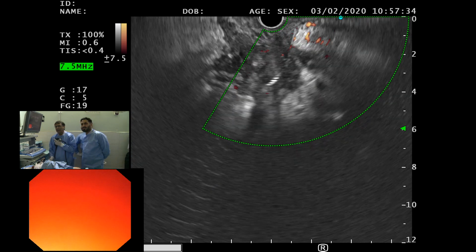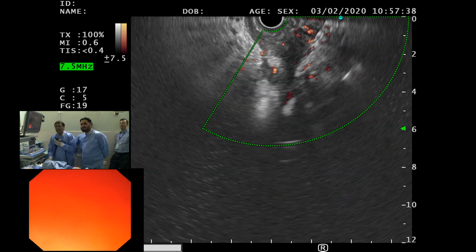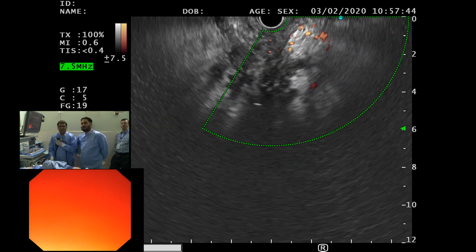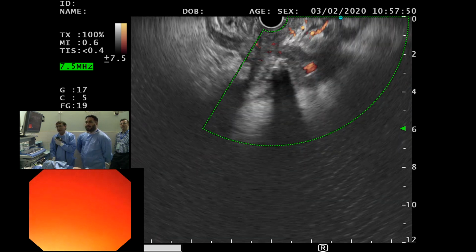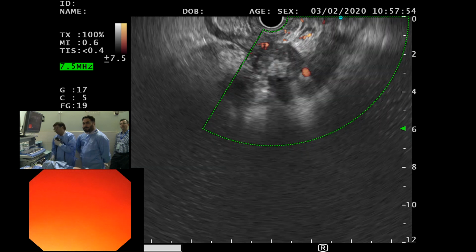I don't see the duct beyond that. This echogenic area is all inflammation. All necrosis. Necrosis is sort of inflammation. Okay. And there is a lot of peripancreatic necrosis, looks like as well. Pancreas in the center, and the area around that is also irregular.